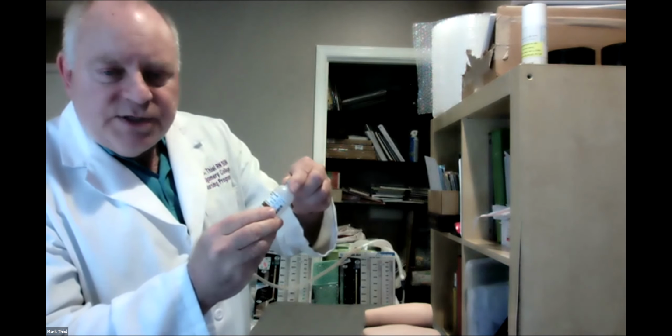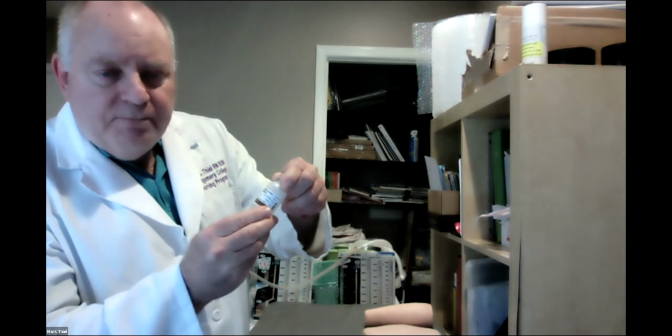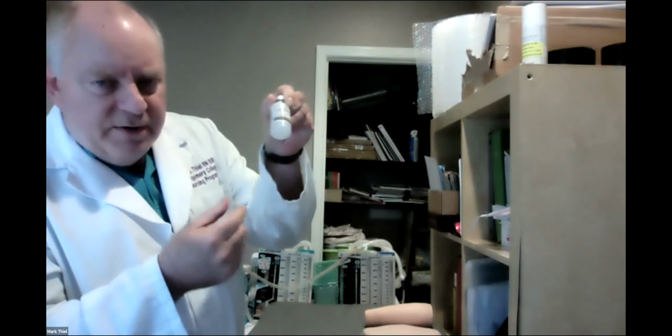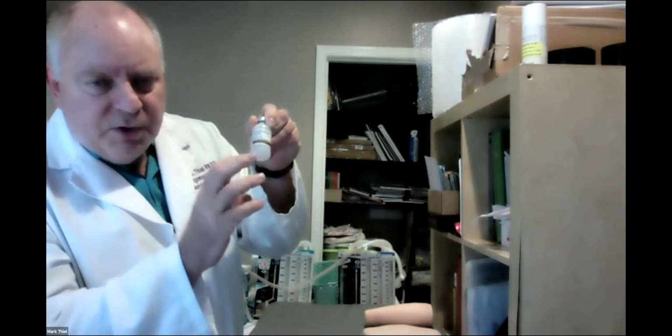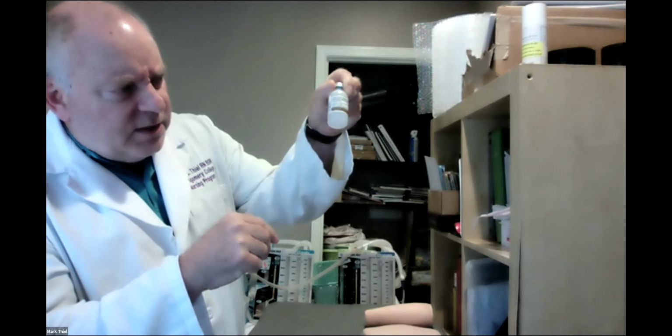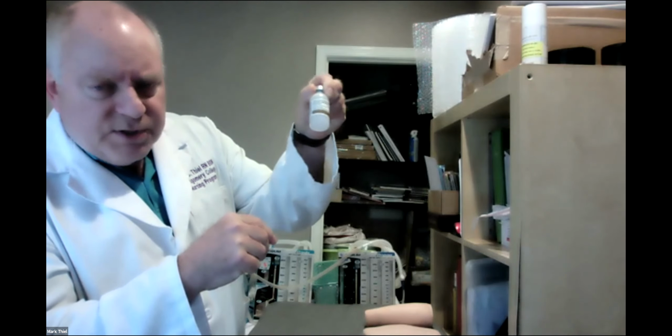The other patient safety addition that we're going to add here is expiration date, condition of the medication, clarity. Now, even though this particular vial is a milky appearance, I can still visualize that the medication is in there, it's clear, and there's no sediment whatsoever.